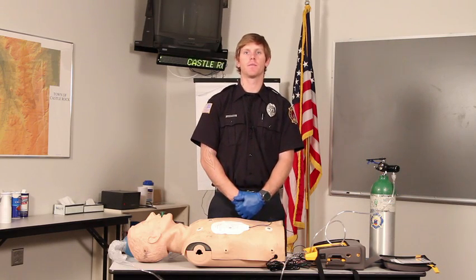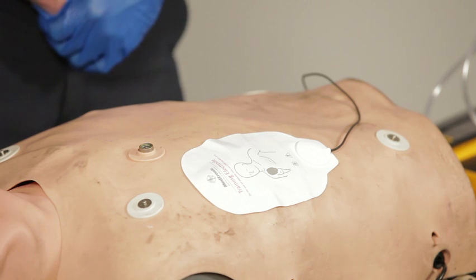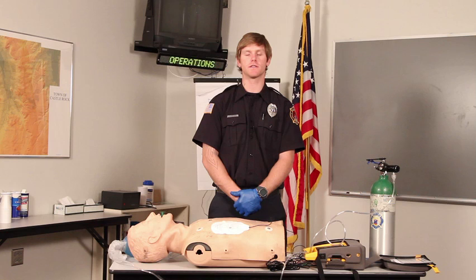Again, to reiterate, before you analyze or shock a patient, you want to make sure yourself and bystanders are clear of the patient. After the second shock delivery, you want to instruct your partner or bystanders to continue another 2 minutes of CPR, and you want to verbalize the necessity for transporting the patient. And this concludes this scenario.